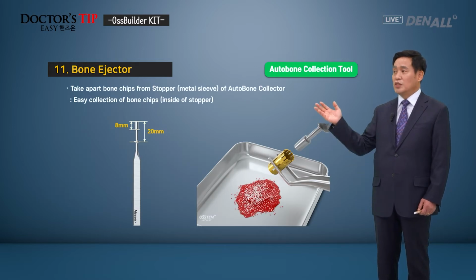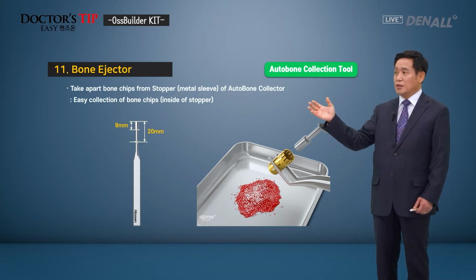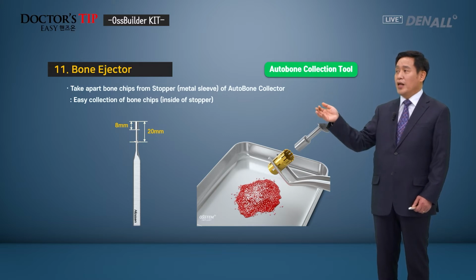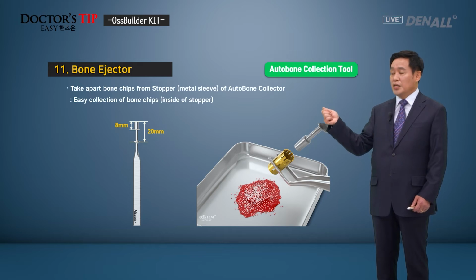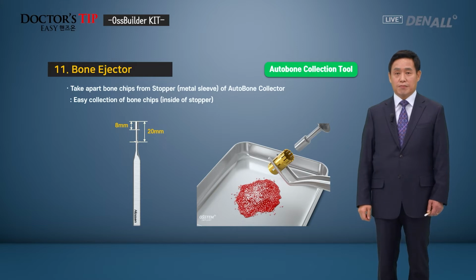Next is the bone ejector. When you use the auto bone collector, the bone chip is inside the metal sleeve, and you'll be able to get it out easily. It has this shape, so you'll be able to get it out very easily, and I'll show you at the hands-on.